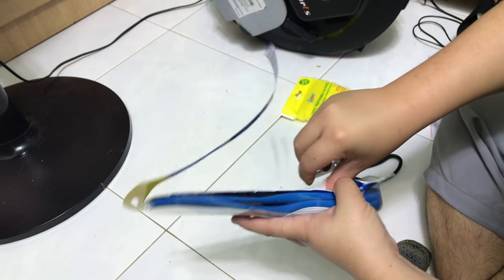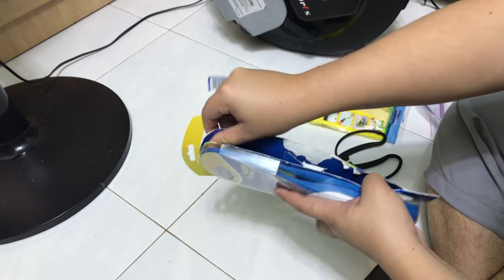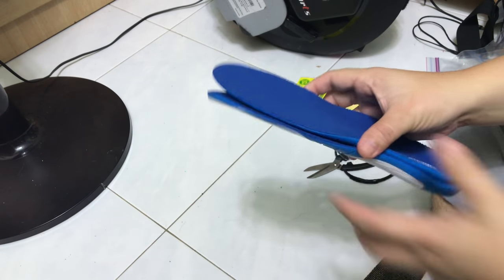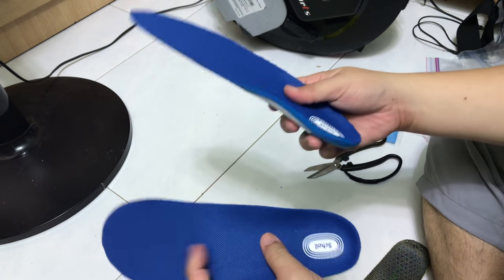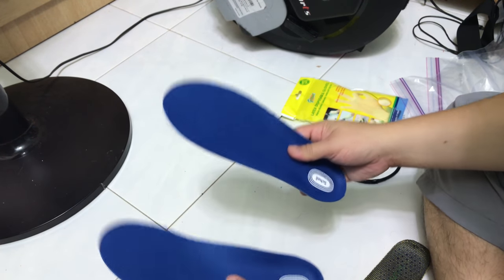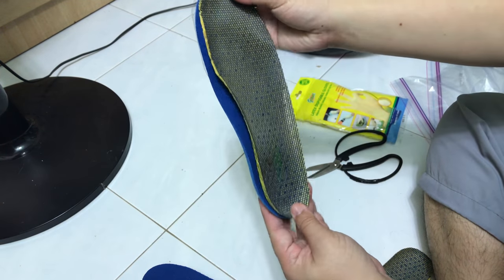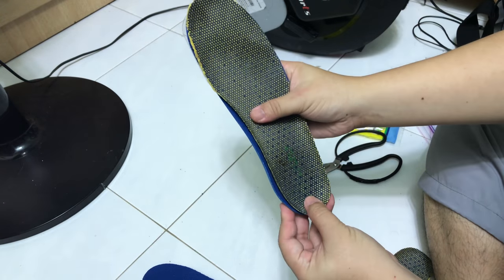You can buy any cheap insole to customize. I got this one — it's a relatively expensive one, this is about 24 bucks. Let me measure the size. I do not need to cut anymore, this is just nice.